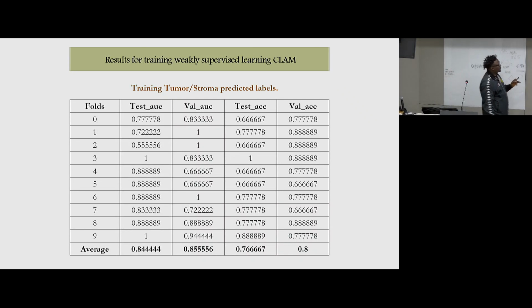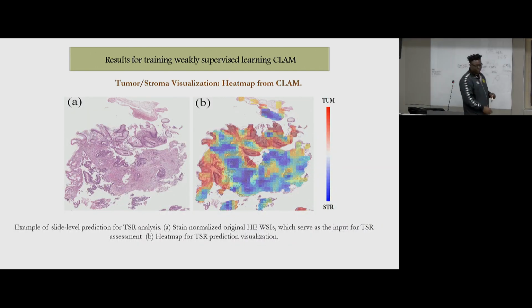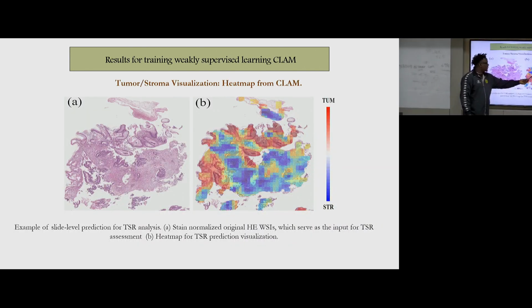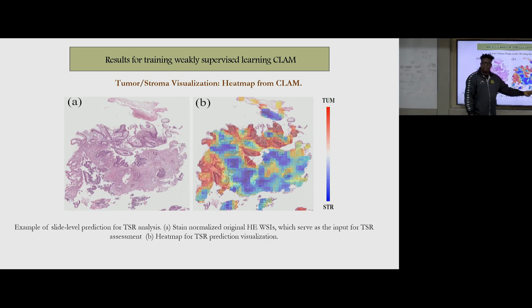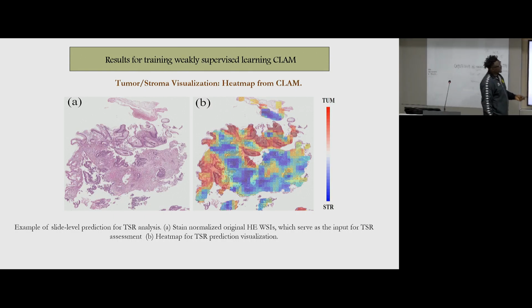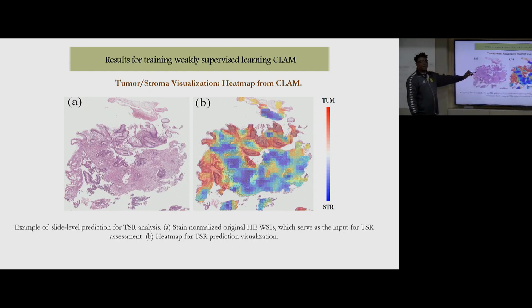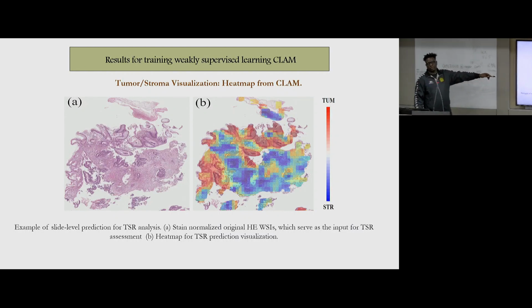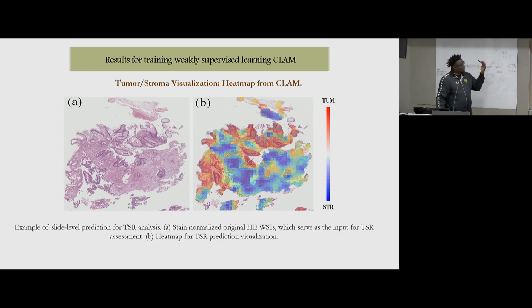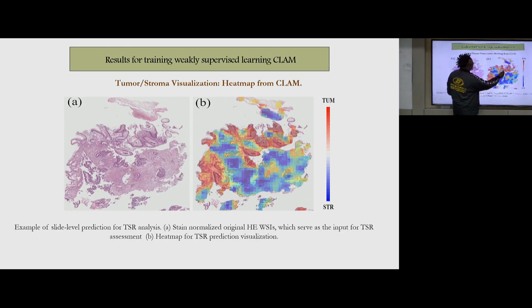When I did this, what I tried to do later is look at this. This is a whole slide image, and this is another prediction. But in this case, I didn't label it as normal and tumor. Like in that case, I labeled it as stroma and tumor. But for this one, only pathologists can give an explanation. The minor explanation I can give is, look at this area. It's a stroma area inside the tumor.